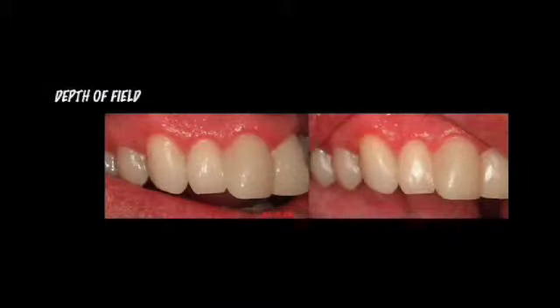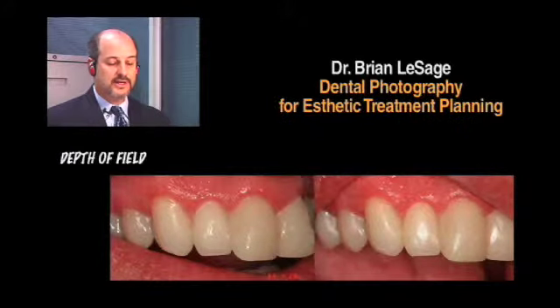Certainly, I hope you can get the sense here. When we look here, these premolars are fuzzy. Okay, they're out of focus. These premolars are not. So what did we do differently between taking these two shots to get these in focus and these not? That's really what we're going to talk about. That's really what depth of field is.